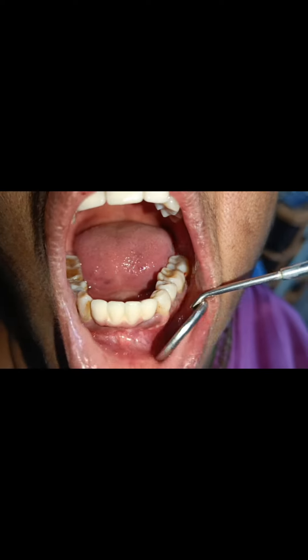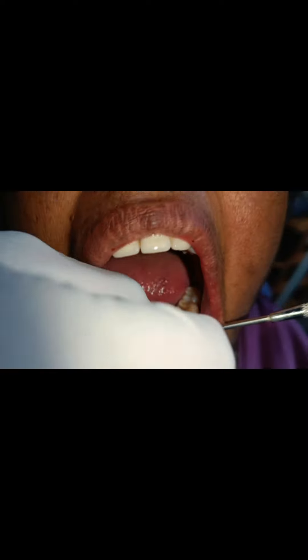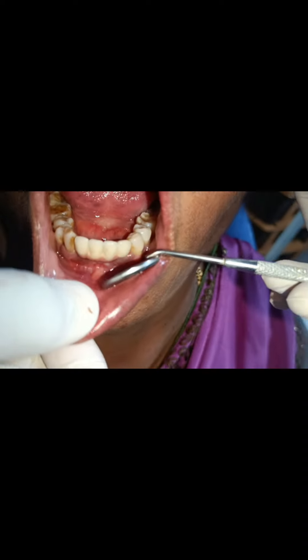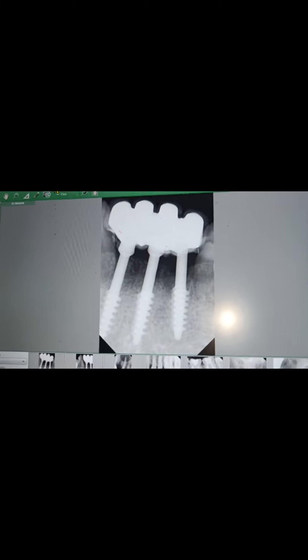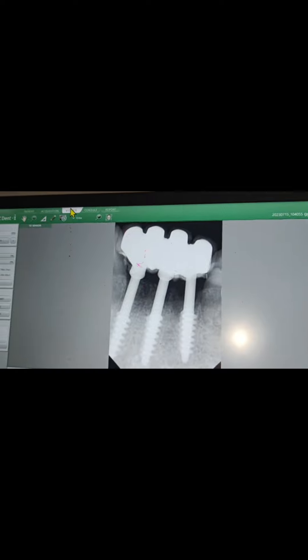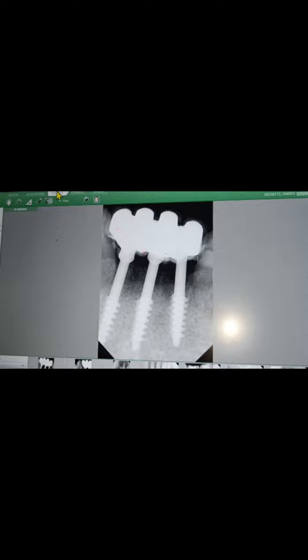It's absolutely doing good — completely firm. On the x-ray, we placed three implants for four teeth. There is absolute healing, good osseointegration of the implants, and no bone loss.